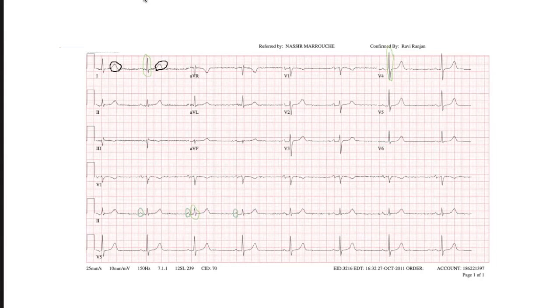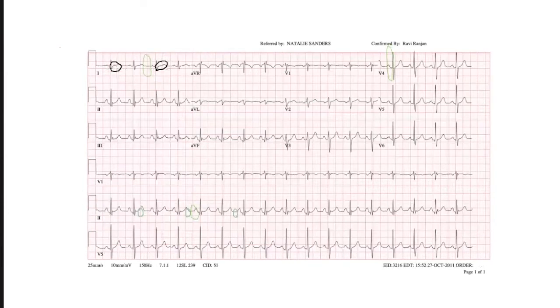And I told it to you when we talked about speeds. Was it the bradycardia? Yeah, exactly. So this one is called sinus bradycardia because you're in sinus rhythm, but your heart rate is slow. So now I'm going to go on to a new one. Questions so far? This all making sense?